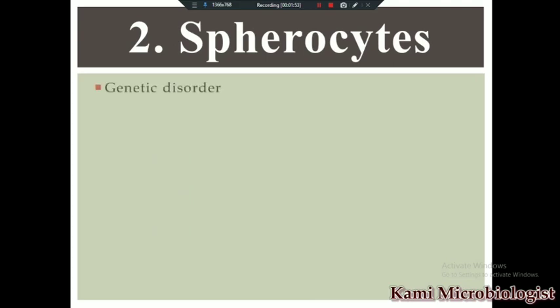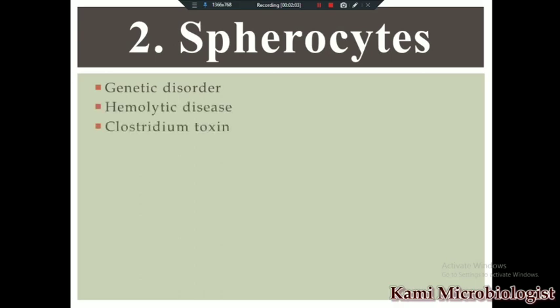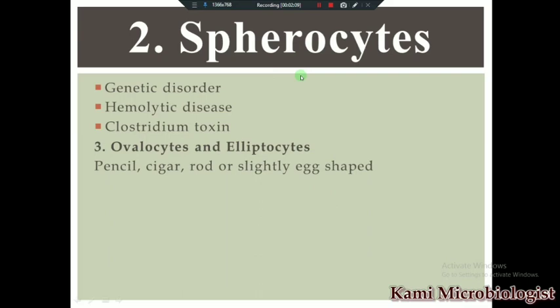Next we have spherocytes. Spherocytes are RBCs that are spherical in shape. Spherocytes are present in cases of genetic disorders, hemolytic disease, and clostridium toxin. These are the main conditions in which spherocytes are seen.